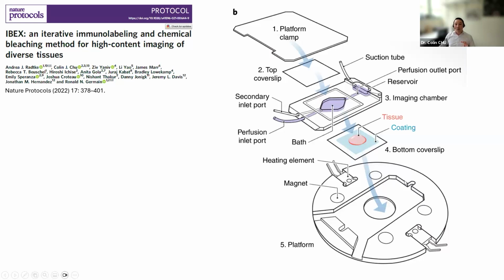Just to touch on the fact, what we did was we adapted many of our antibodies to do the staining for 1 hour at 37 degrees on the microscope stage. And actually, it was incredibly surprising how many antibodies do work very well using that approach, particularly high affinity monoclonals, ones that you might have adapted from, say, flow cytometry. But you can also extend the length of staining perhaps to 2 or 3 hours for those harder to stain targets. So I'd encourage everyone to think about potentially speeding up your staining workflows.